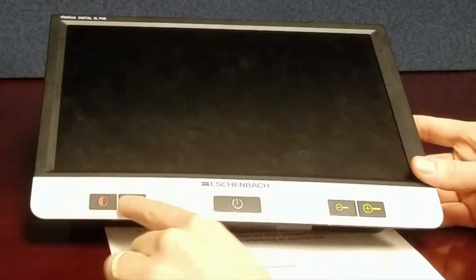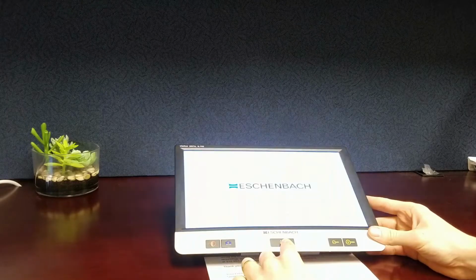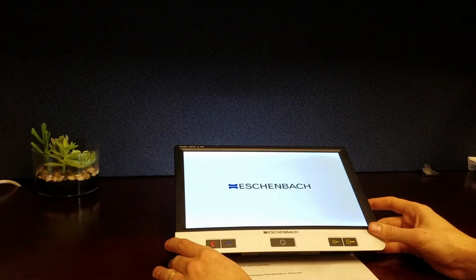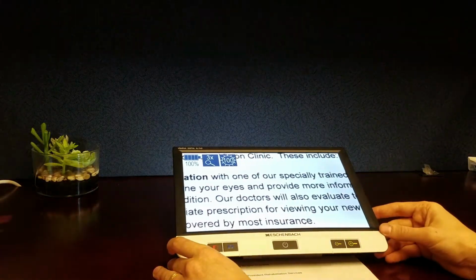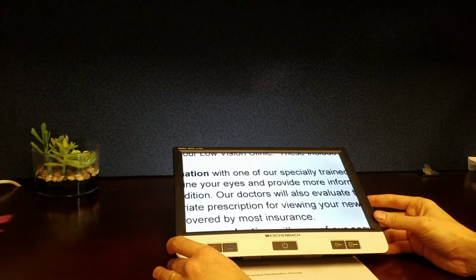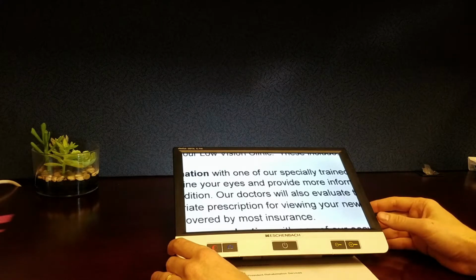So the most basic control is going to be our power button, and we're going to go ahead and hold that down for a couple of seconds now, and the screen will come on. Get a nice Eschenbach logo there, and after a couple of seconds we're going to see whatever the camera is looking at. In this case I have a flyer underneath the device here. And so we're currently at 3 times magnification, and because of the large screen we get a lot of text on there, which is very nice.